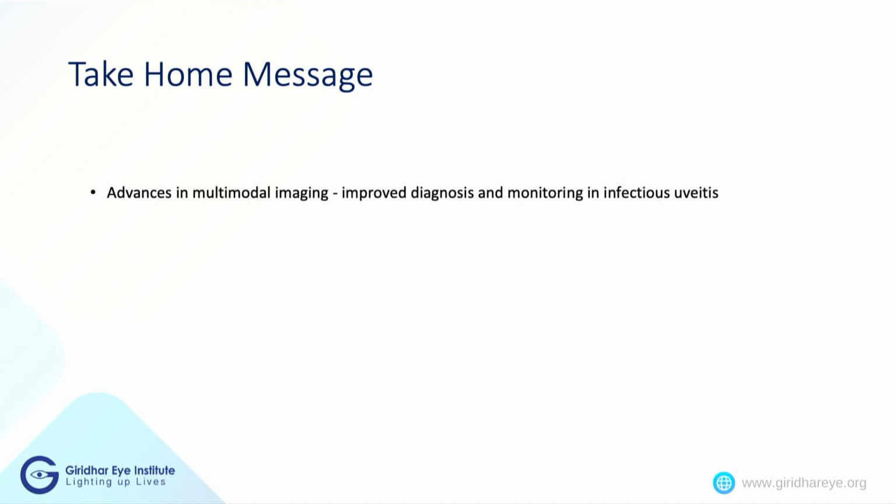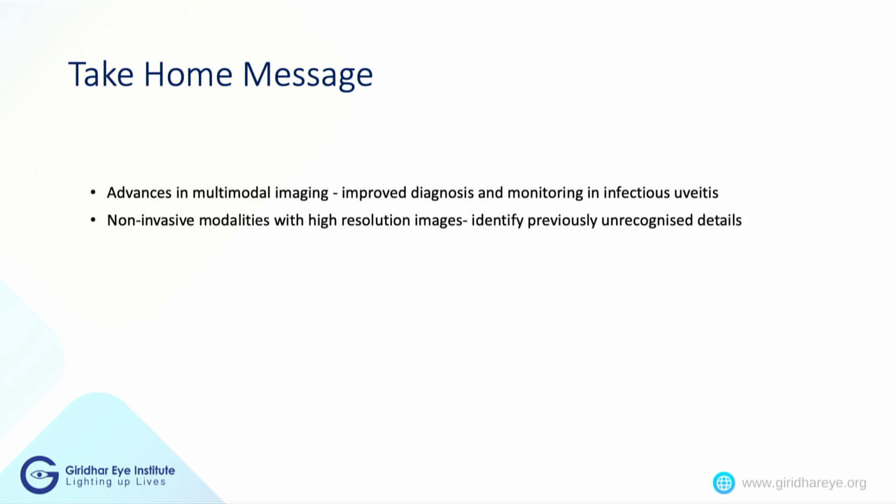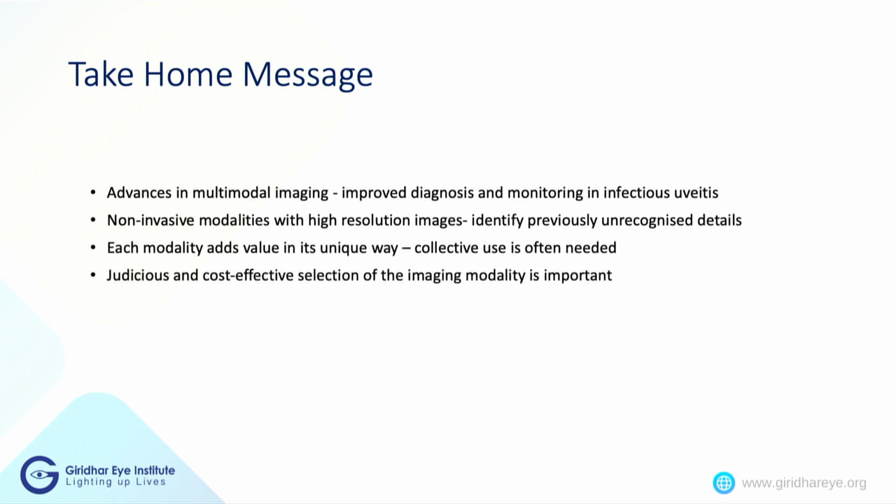So advances in imaging have helped us to improve diagnosis and monitoring in infectious uveitis. Non-invasive modalities with high resolution images are helping us to see many details which we have never seen before. Each modality adds value in its unique way, so collective use is often needed, and judicious and cost-effective selection of the imaging modality is also important.